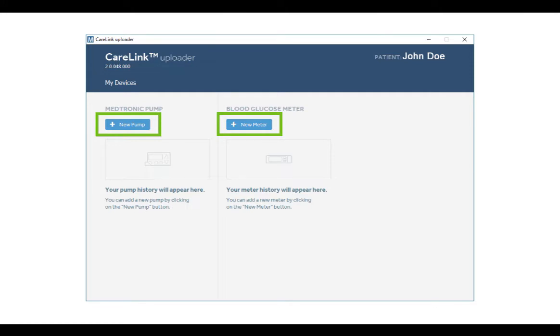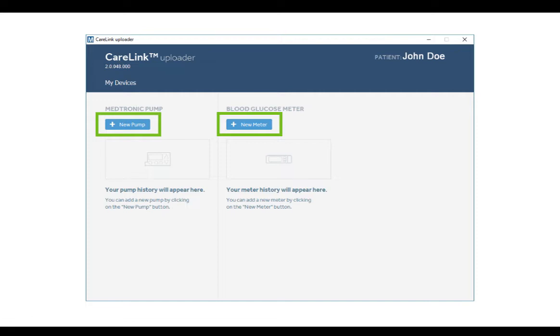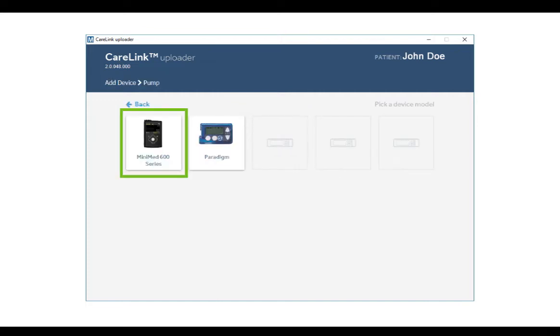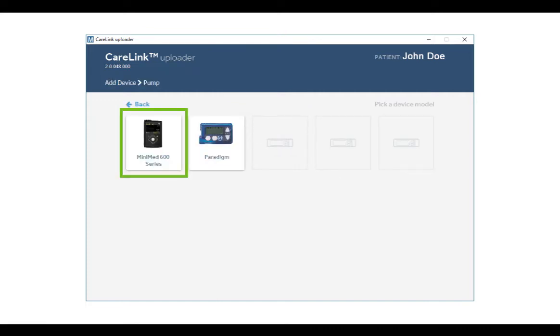Choose whether you want to upload a pump or meter. In this example, to upload your pump, click Add New Pump. Select your pump model. Select MiniMed 600 series and click Next.